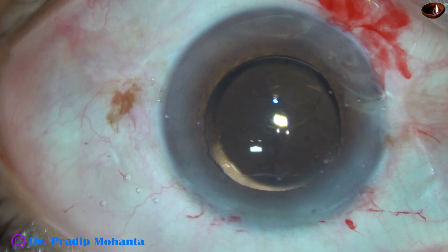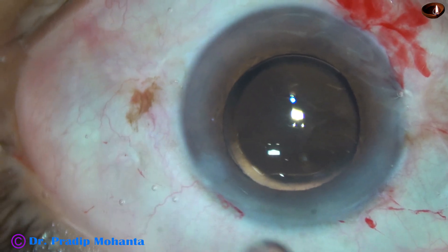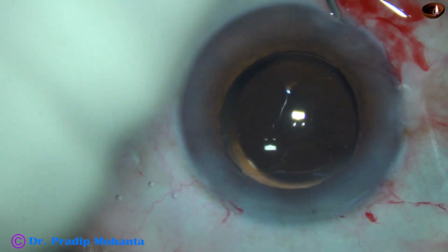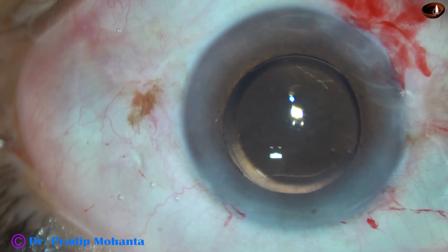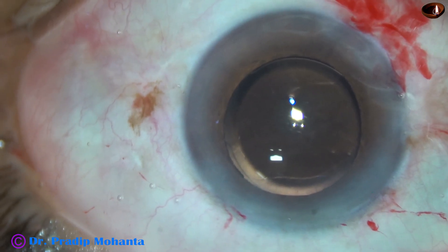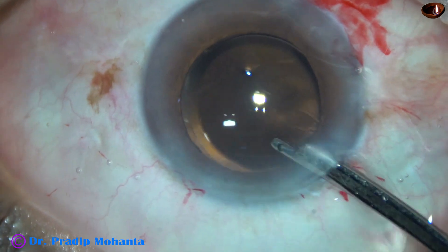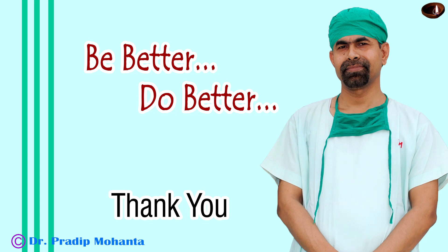This is moxifloxacin. Now the side ports are to be closed. Corneal stroma on either side of these stab wounds are hydrated, and the stab wounds get closed. So, whenever there is a small rent, it is better to prevent all rents, but when it has already occurred, we can convert the rent into a PCCC and implant a lens in the capsular bag, and we can leave a small amount of visco in the anterior vitreous. Thank you very much for your attention. I hope this video will help you in developing your surgical skills. Be a great surgeon and serve your patients with love, respect, empathy, and great surgical competence. Thank you very much.